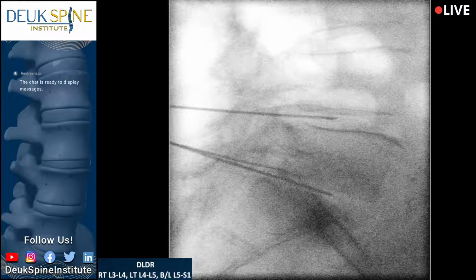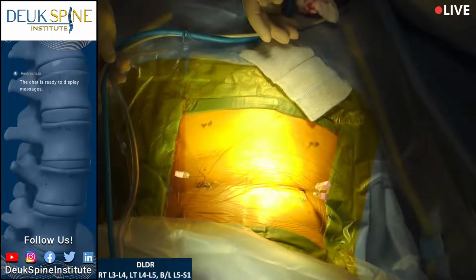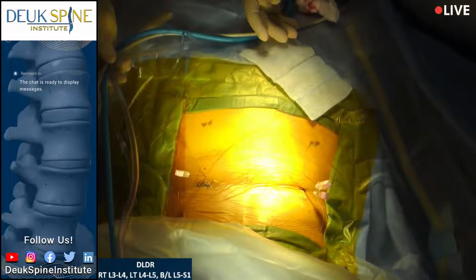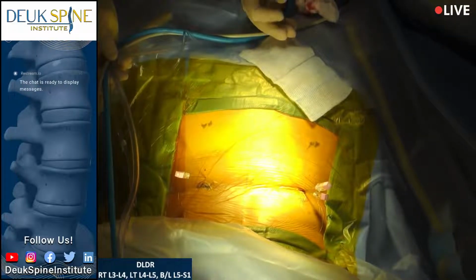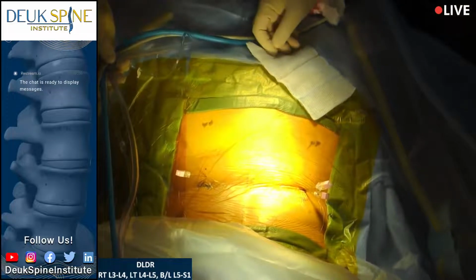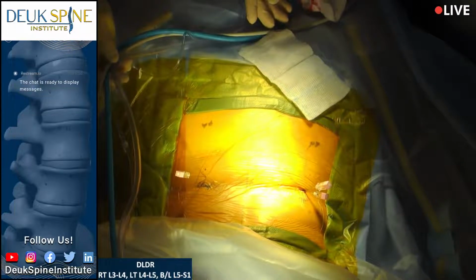Let's do a little WAG. I think we're off on WAG just a little bit, and maybe even a small amount of orbit. Can you clean up the 5-1 disc a little bit, Shot? That's worse. Let's go the other way on WAG. It's really important if you're going to do navigation with an X-ray machine, folks, that you have the X-ray lined up with the spine. Oh, see how that changes everything. Interesting. Yeah, that says we're in the right spot.